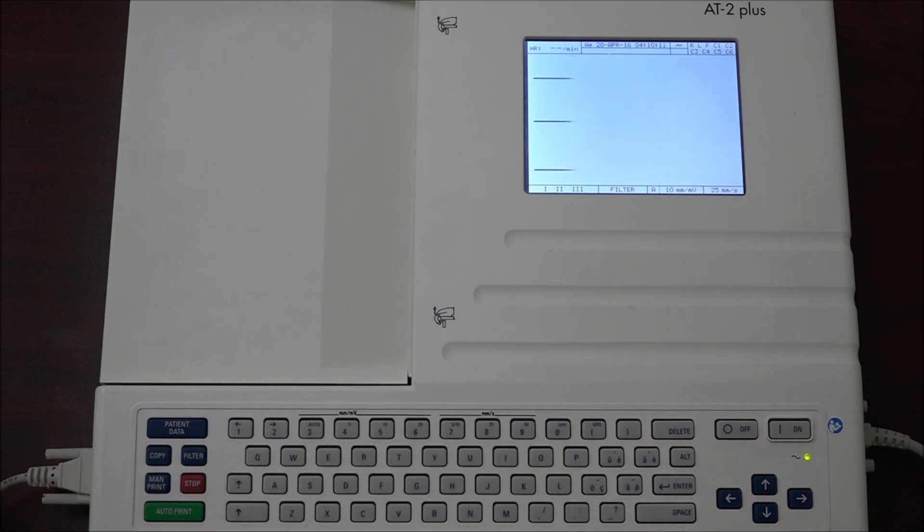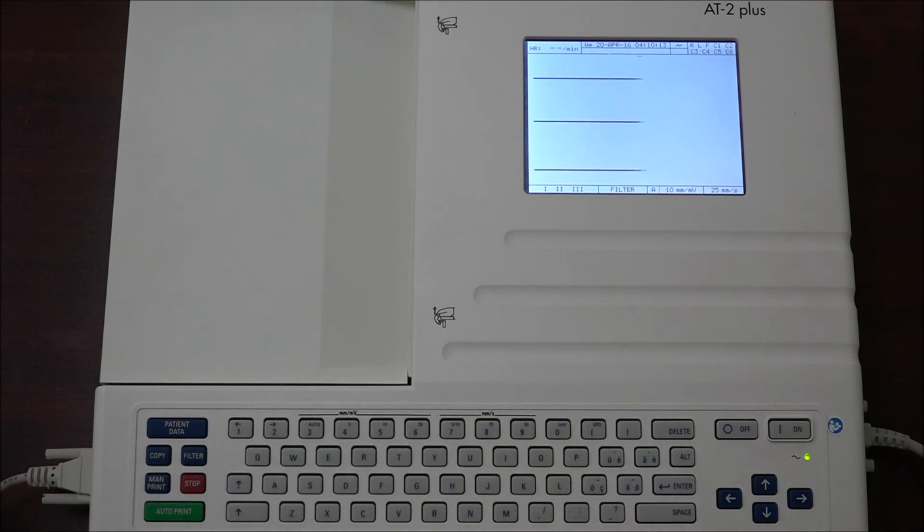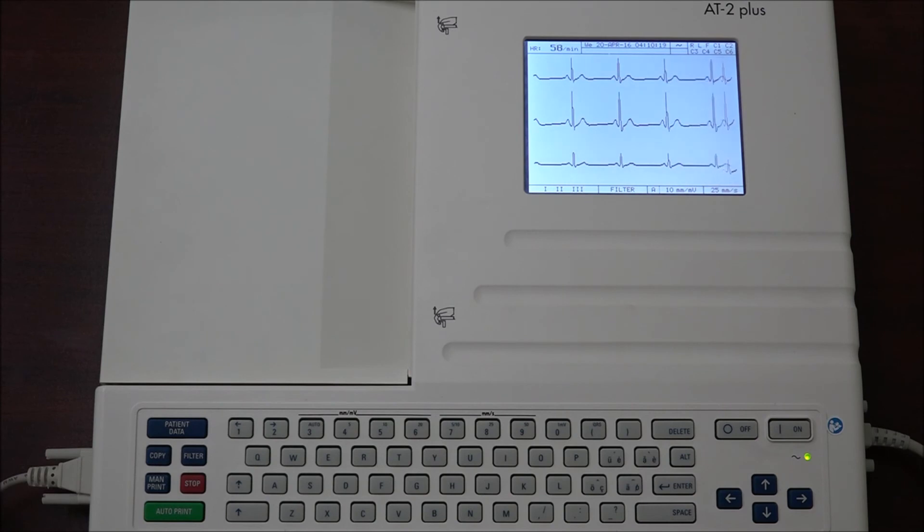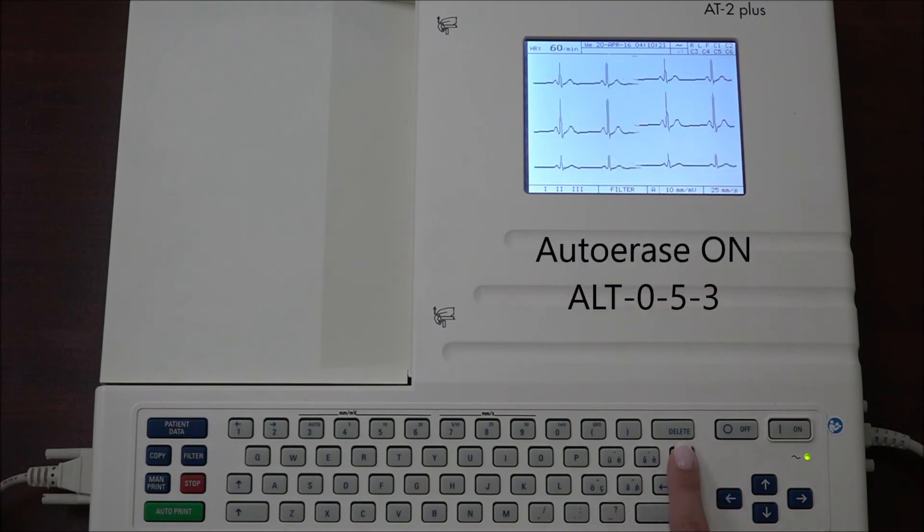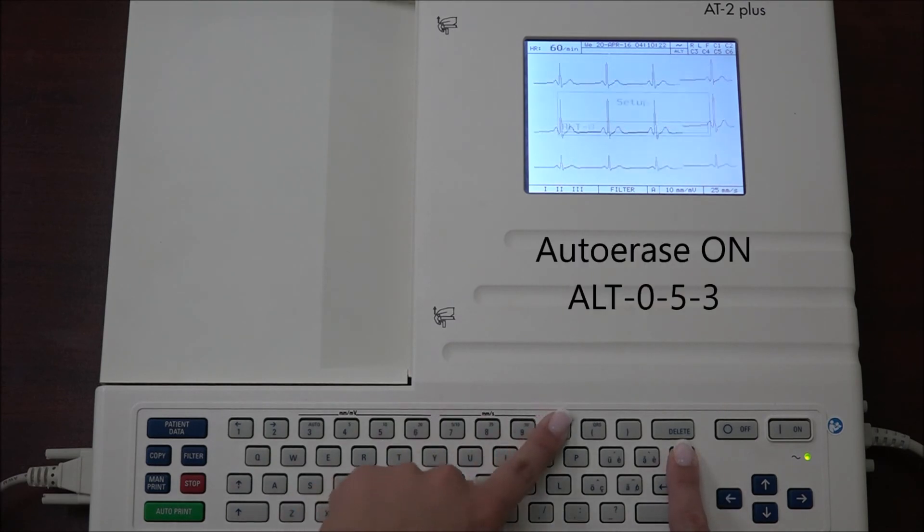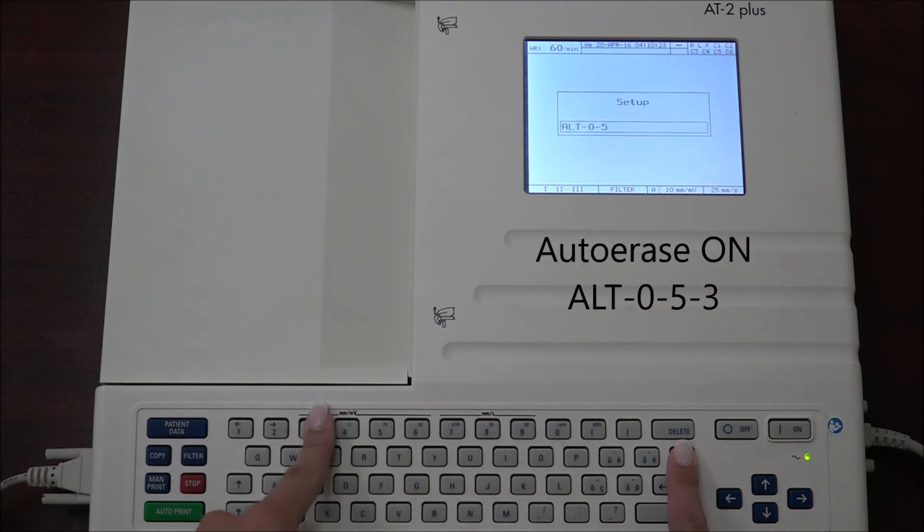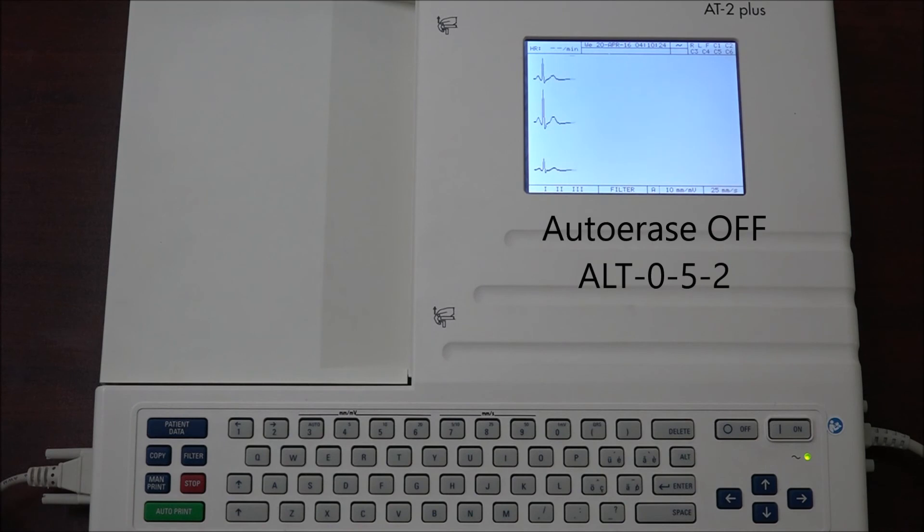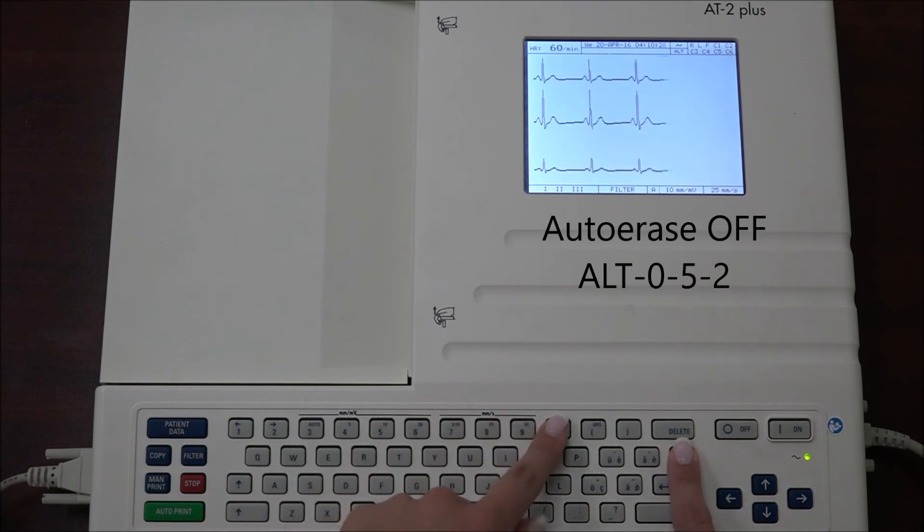We can also set the auto erase on. When on, this will erase all stored recordings after having sent them. To do this, press ALT 0 5 3. To turn off auto erase, press ALT 0 5 2.